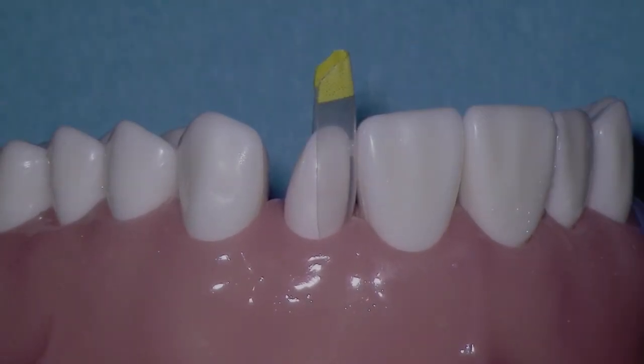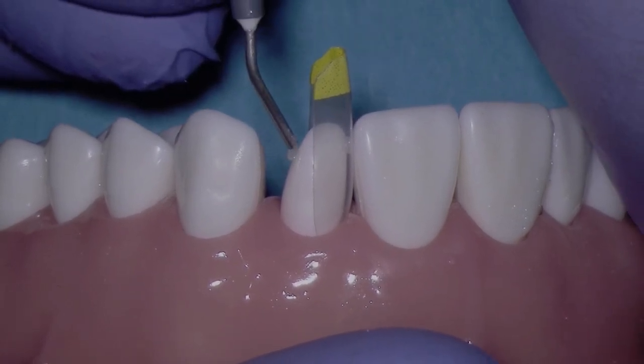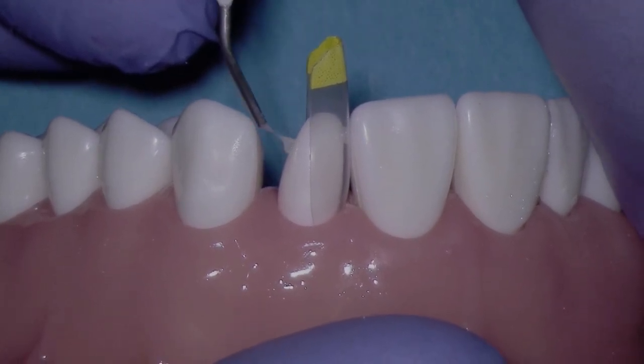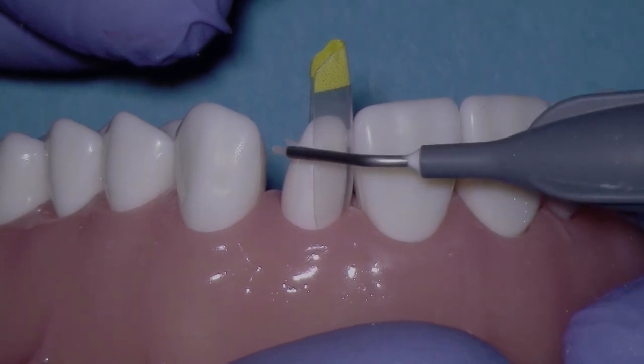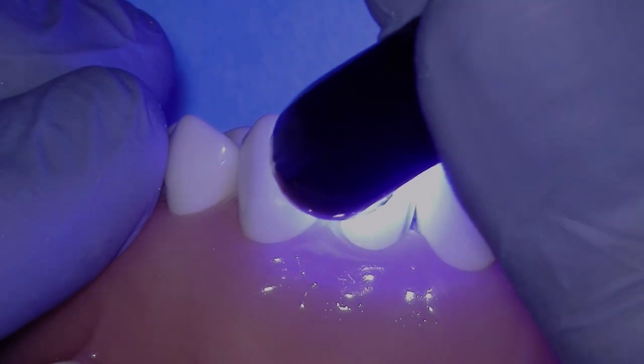At this point, I'm going to use the unflattened cannula for the composite. So I'm going to bring the flowable in here, and then I'll put some flowable on the contact area here, and then let's cure.